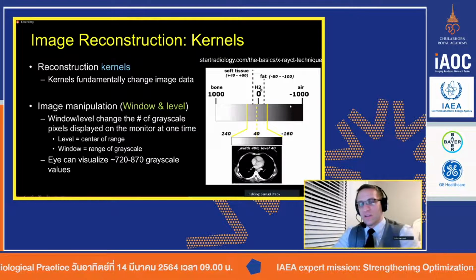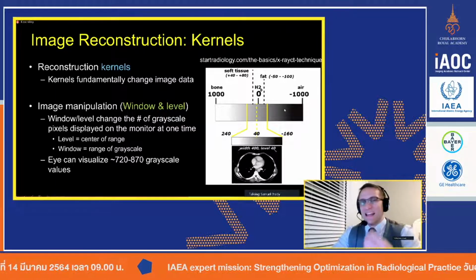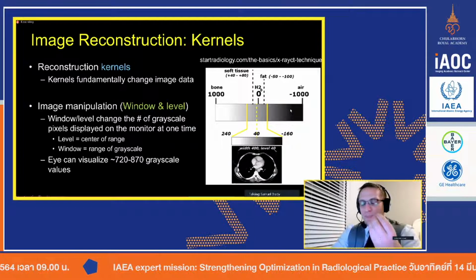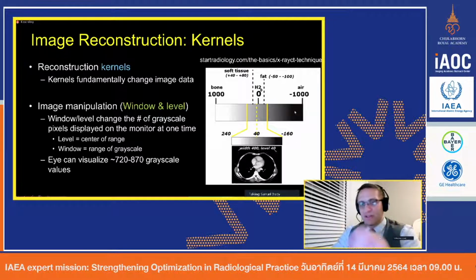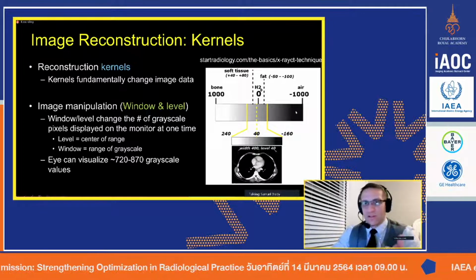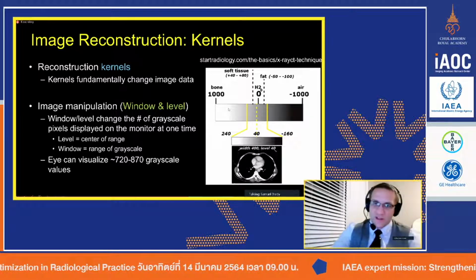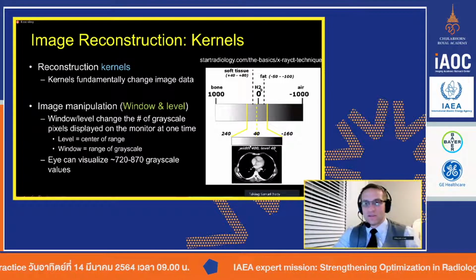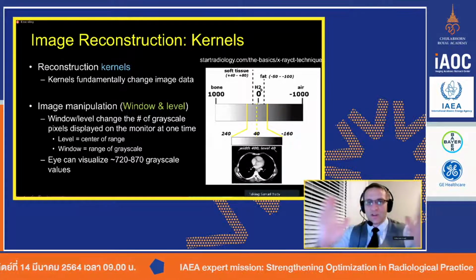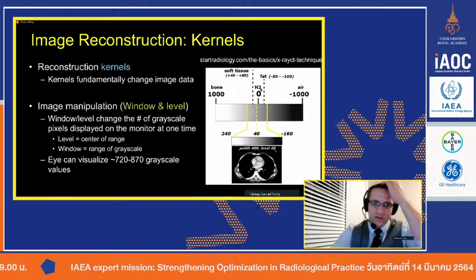If we set the window level towards a negative value, we're going to be focusing on less dense tissues, such as air-filled cavities like lungs, or fat. They appear darker. And obviously, if you shift it to the other side, you're focusing in on the bones or the contrast-enhanced tissues. Then we set the window width just to give us the overall range of the grayscale images we want to look at.